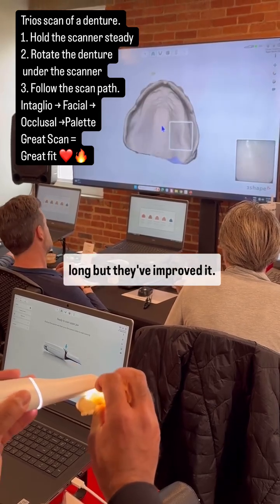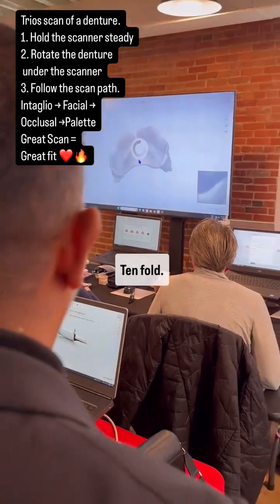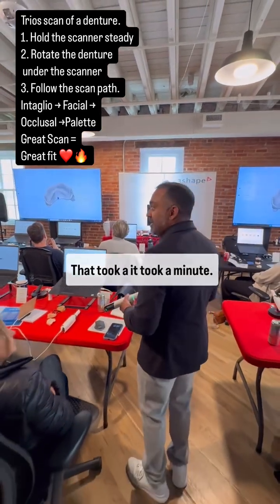This is what used to take so long but they've improved it tenfold. Even while explaining it, that took a minute. It took a minute.